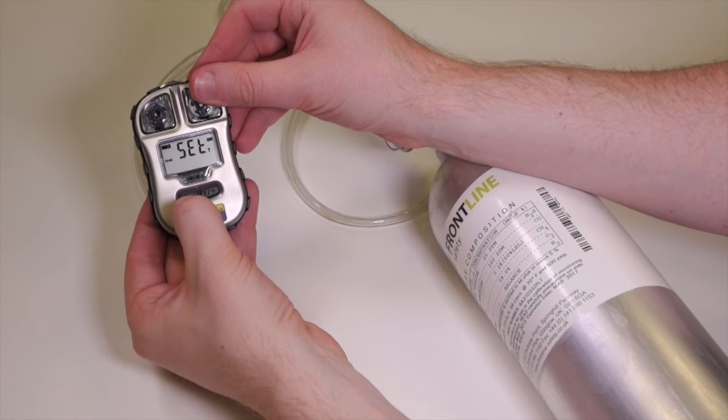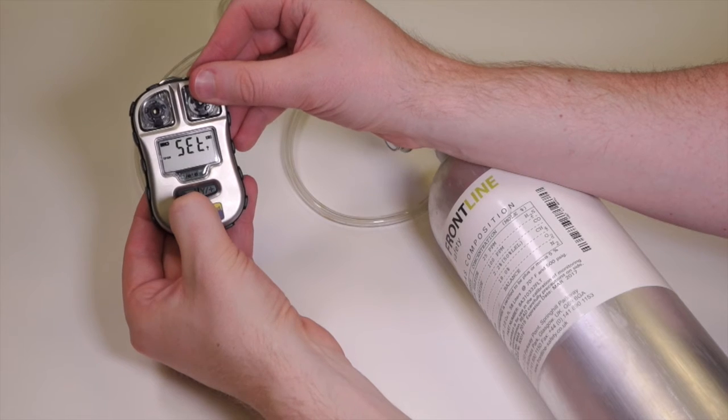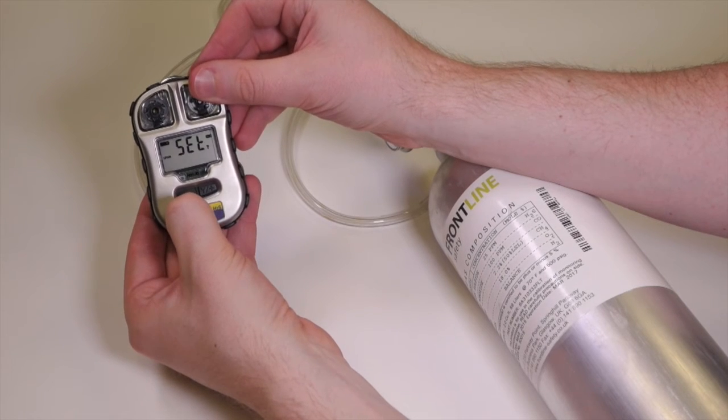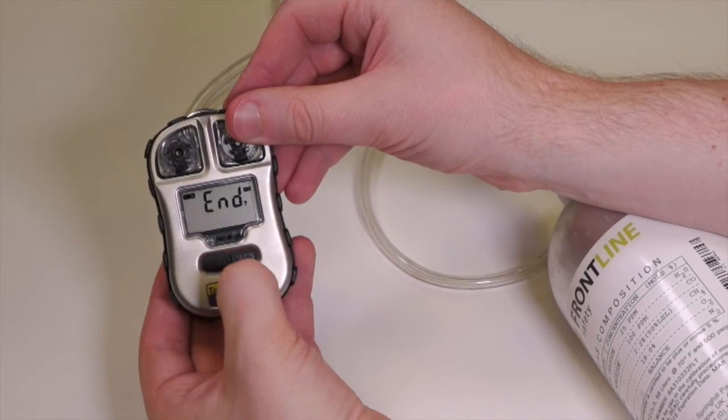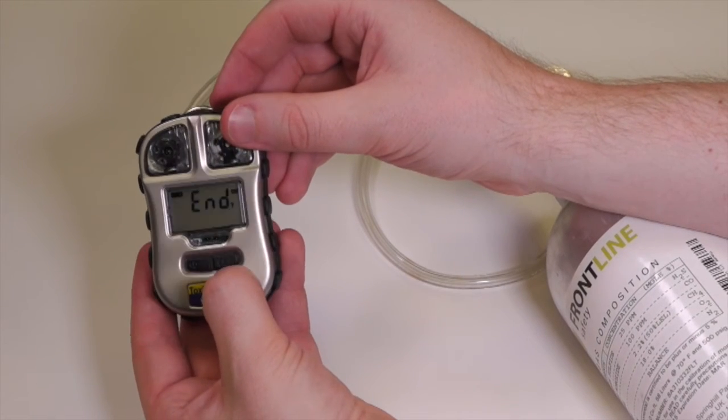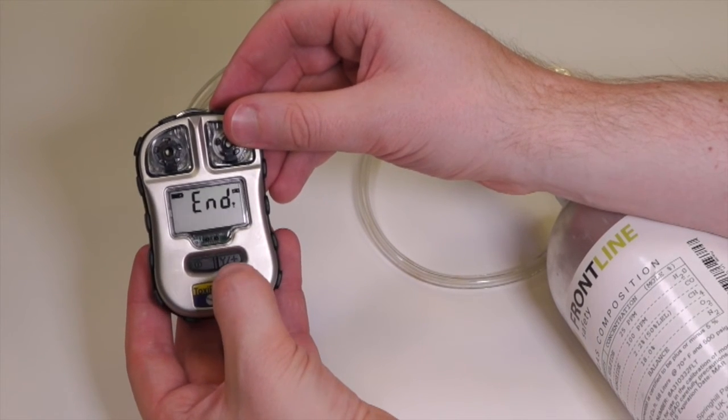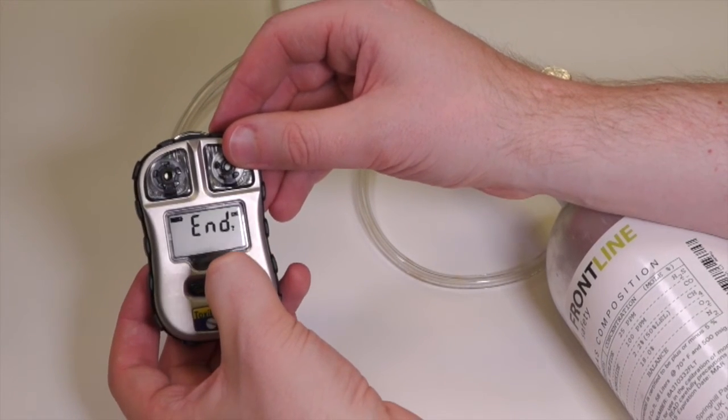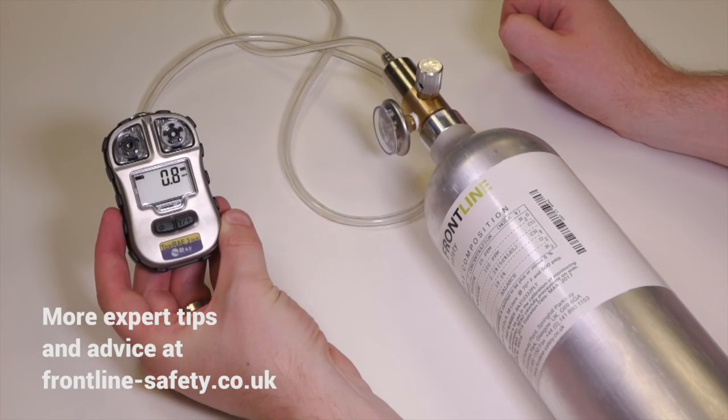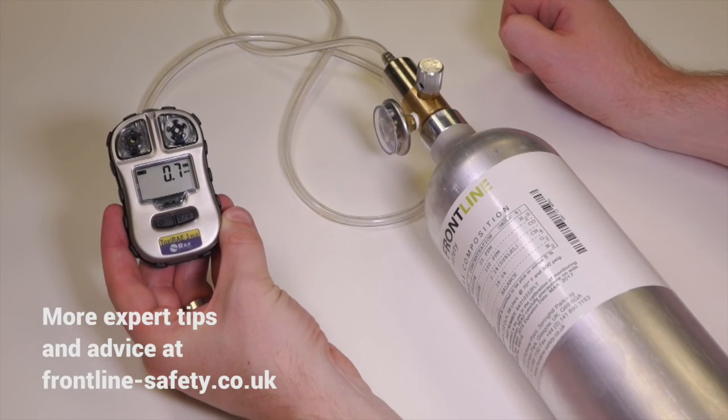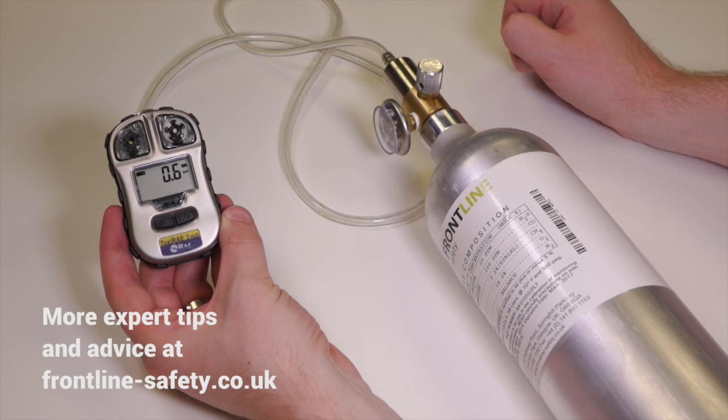So the calibration is now complete so you just need to get back to measure mode and you do that by using the left hand button just to navigate your way through the menu until we get to end. Yes we want to end or get out of the calibration menu so acknowledge it by saying yes and that takes us back to measure mode. So that's how quick and easy it is to calibrate the ToxiRAE 3 H2S from RAE Systems.